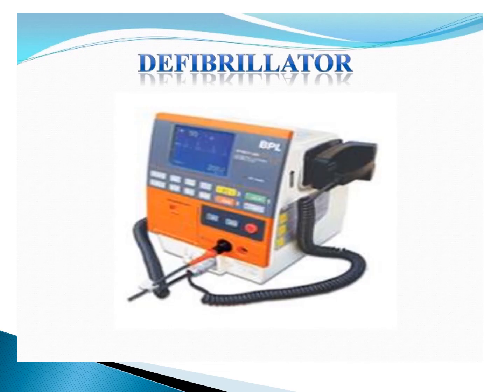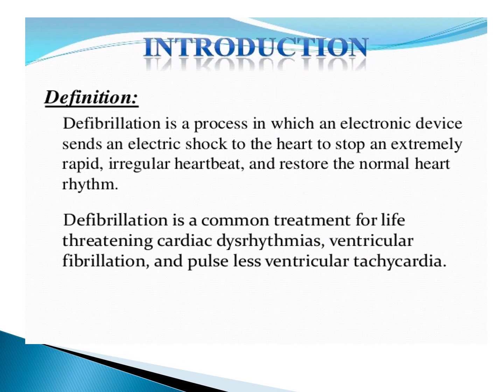So this is the model of a defibrillator. You can see the paddles, which we will keep aside, and the ECG readings. So we can keep the ECG strip and take the readings, and all the modes are available in the defibrillator, and we have to charge the defibrillator.